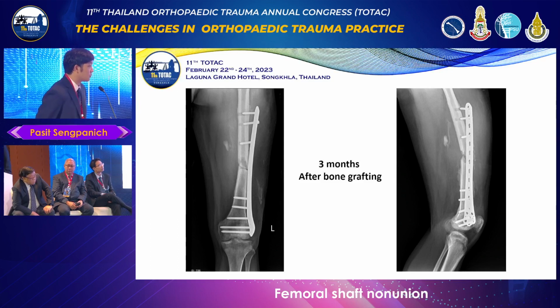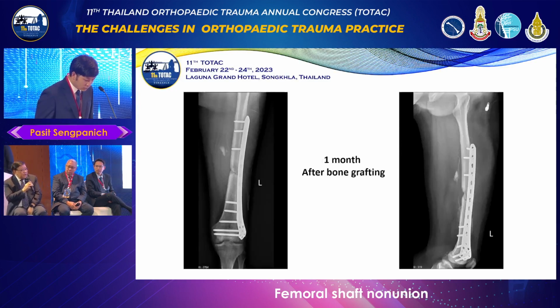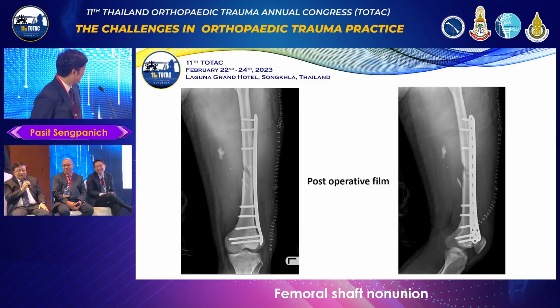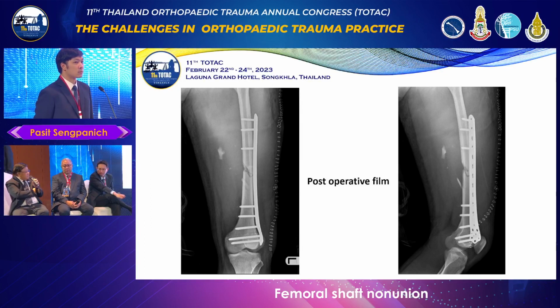Any comment from Professor Suthorn? Yeah, when I look at the immediate post-op X-ray, I think you have a very long incision all the way up. I don't know whether this is minimally invasive or maximally invasive, right? Number one. It's sometimes difficult to decide how many screws we will put. In this case, probably the spanning is too much. If you span, I don't know, a 6-hole plate, right? If the spanning is too much, I understand that we want relative stability, right? But if the span is too much, it's not relative stability, it becomes instability.